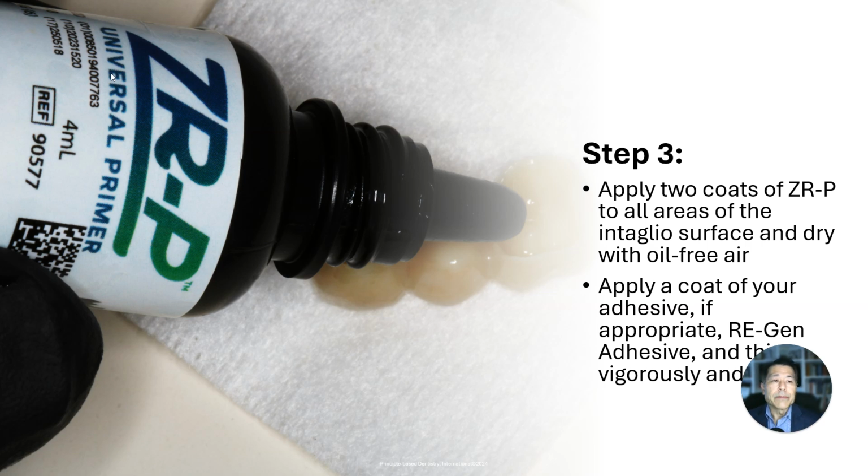Now step 3 is applying 2 coats of ZRP. ZRP is our primer. It's got 3 different monomers that help our composite luting cements stick to the zirconia. So apply 2 coats of the ZRP to, again, all the intaglio surface area inside that restoration, and then dry it with oil-free air.